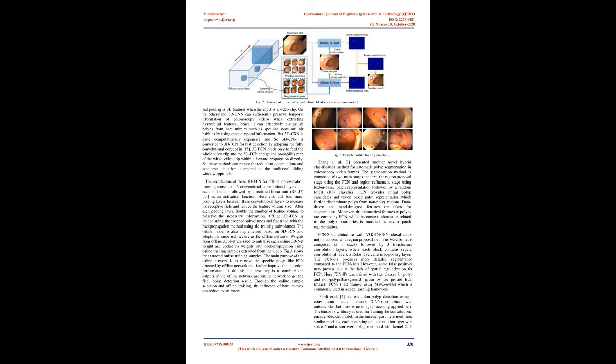We make a review of the most recent papers on polyp segmentation in colonoscopy images. Yu et al. adopted a novel offline and online three-dimensional deep learning integration framework to automatically detect polyps from colonoscopy videos by leveraging 3D FCNs. Offline 3D FCN is first developed and exploited for learning spatiotemporal features from the training samples extracted from colonoscopy videos. Here they explore 3D CNN to learn spatiotemporal features from colonoscopy videos for automated polyp detection. This is the first approach that employs 3D CNN for endoscopic video analysis. Fig. 2 shows the flow chart of the 3D deep learning framework.